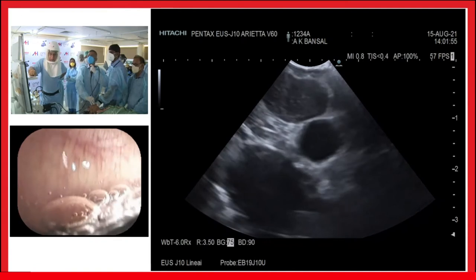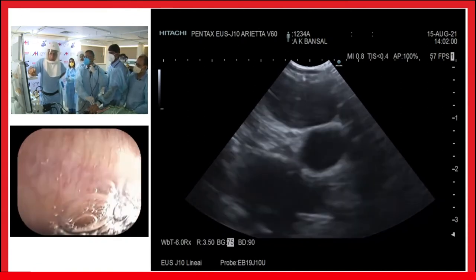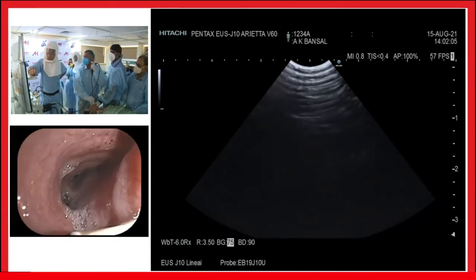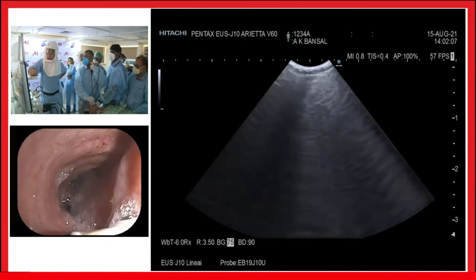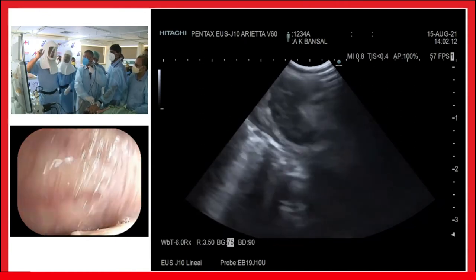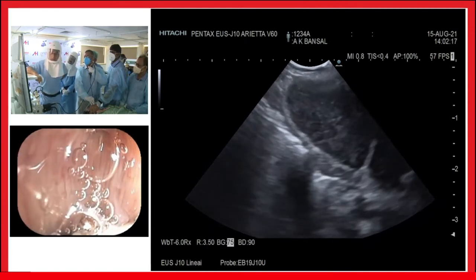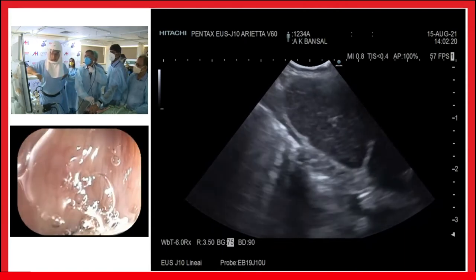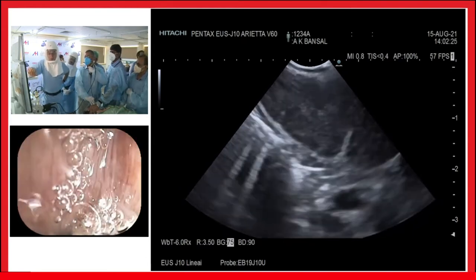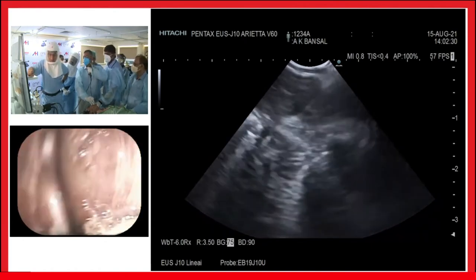This is where it becomes a little bit murky. Can we take assistance of your endoscopic distance? Are you in the trachea, or were you just about to slip out of it? We are just in the trachea, the lower end of the trachea. If you are in the lower end, I would call it 4R. Okay, so I will call this lymph node 4R. This is also pretty enlarged, as you can see. And I definitely need to see some relationship if you are finding a 4R with vessels, whether the rotation will show some vessel.